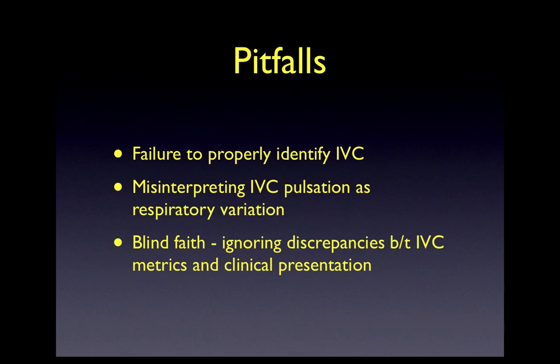Lastly, blind faith is a pitfall. When you have IVC metrics that do not fit the clinical presentation, you need to reevaluate your IVC study and make sure, for example, that you're indeed looking at the IVC, and you also need to be reevaluating your patient to try to reconcile the difference. If the difference cannot be reconciled, then you have to ignore your IVC study and treat the patient as if you didn't have the ultrasound result.